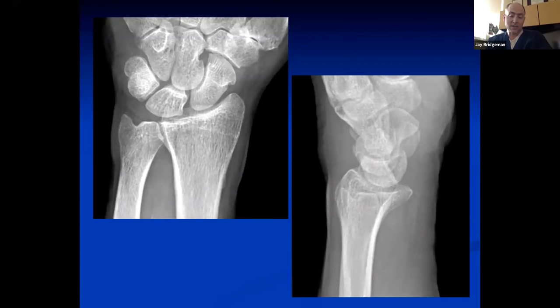I don't think it's a small fracture — I think it's a serious fracture. I can see how it could be interpreted that way from the ER, but one thing concerning on the lateral view is the teardrop angle with the volar rim — it almost looks vertical when it should be at 70 degrees.